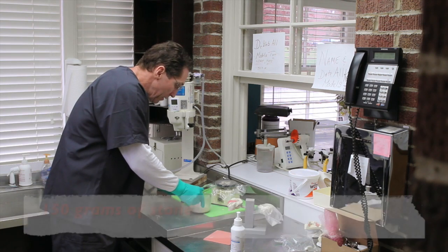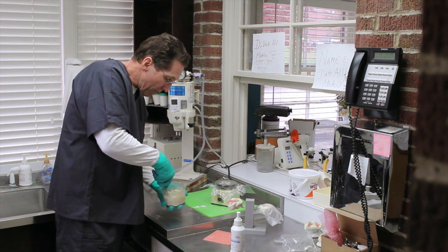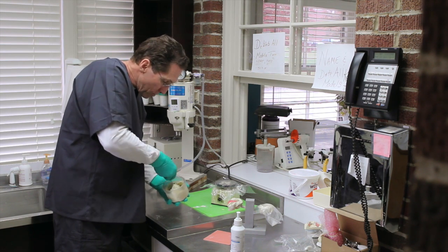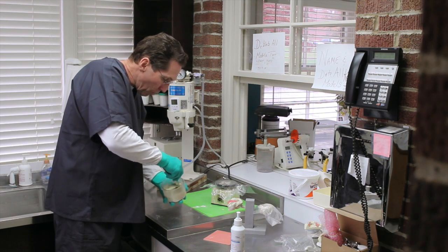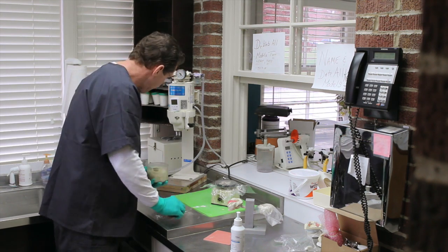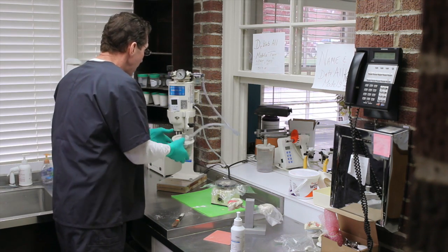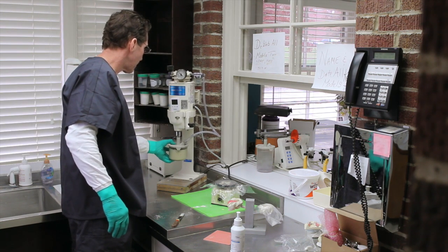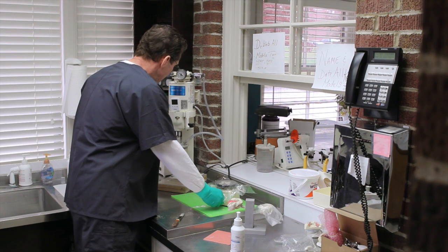We're going to go ahead then and pre-mix this, because the vacuum mixer is not so much to mix, it does mix, but primarily to remove the bubbles from it. So we'll get pretty much the stone and water incorporated. We will then take it to the vacuum mixer here, and we will let that go for 30 seconds, during which time I will turn the vibrator on.